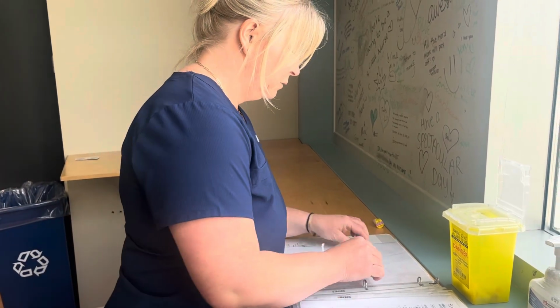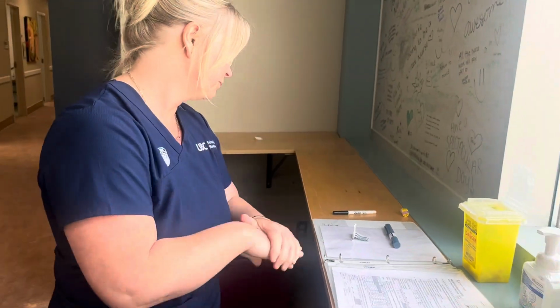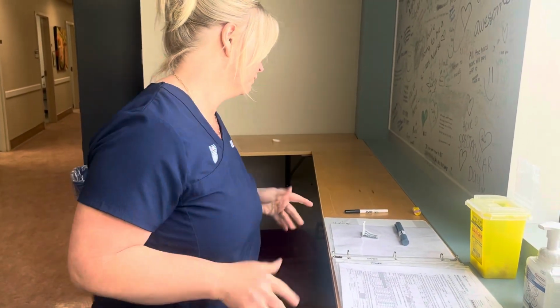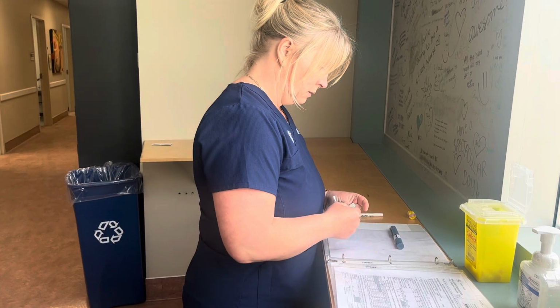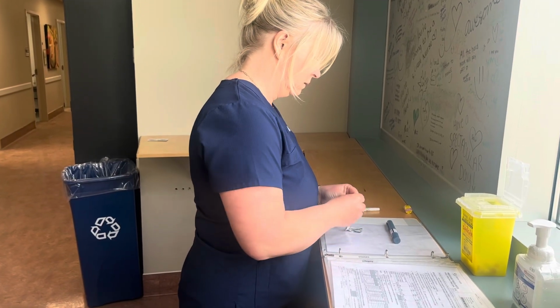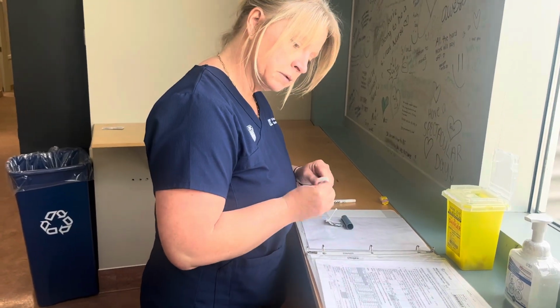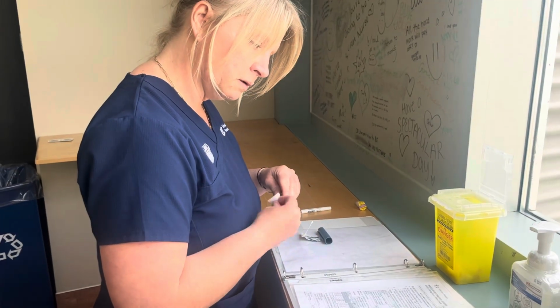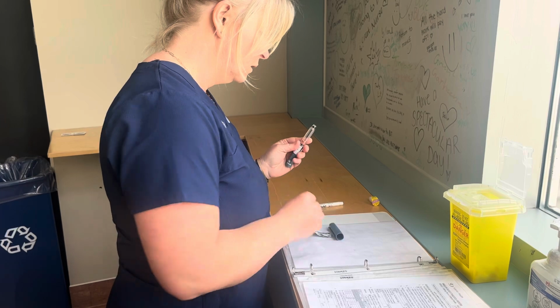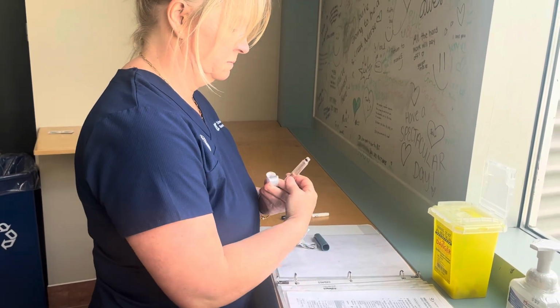Okay, before we do that, let's get organized. Do some hand hygiene. So, alcohol swab this really well. Let that air dry for about 30 seconds.